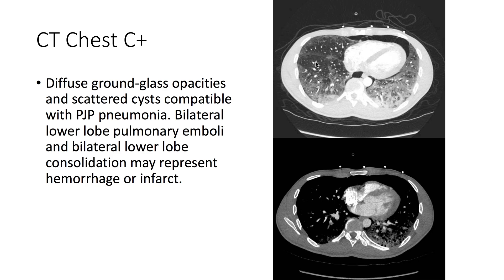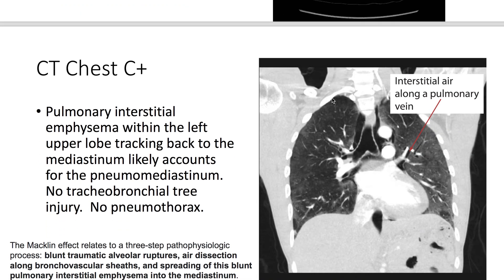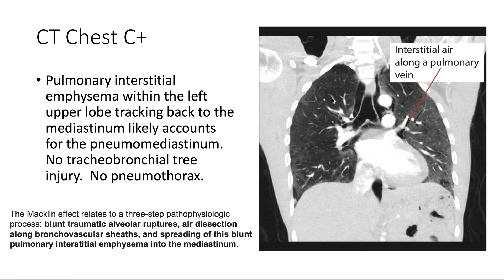There are also bilateral lower lobe pulmonary emboli and bilateral lower lobe consolidations, which may represent hemorrhage or infarct. There's also pulmonary interstitial emphysema within the left upper lobe tracking back to the mediastinum, which likely accounts for the pneumomediastinum. There's no tracheobronchial tree injury and no pneumothorax. The Macklin effect relates to a three-step pathophysiologic process.